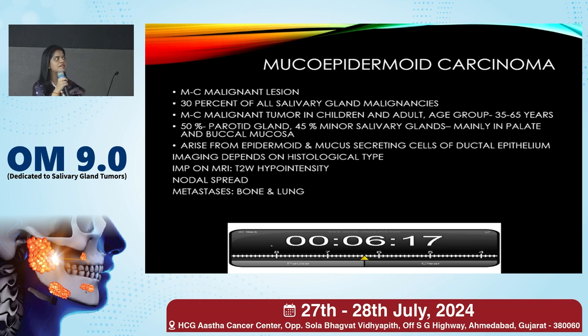The imaging of such tumors depends on the histology. If it is a low grade, it will be well defined. However, if it is a high grade tumor, the margins will be ill defined, and importantly, these have a nodal spread.